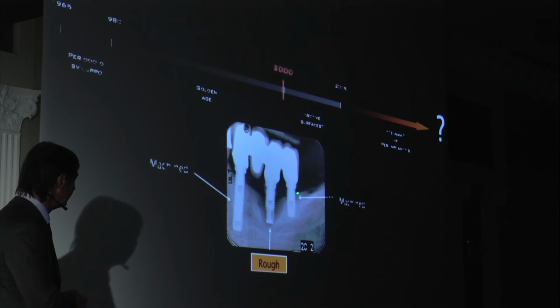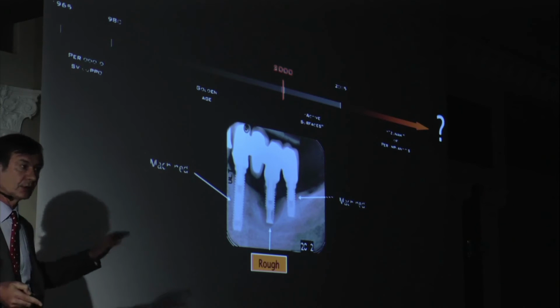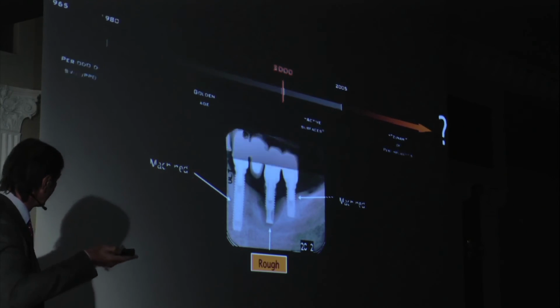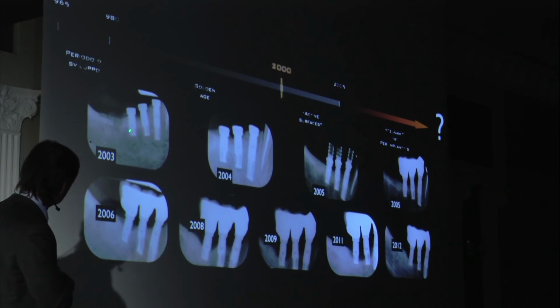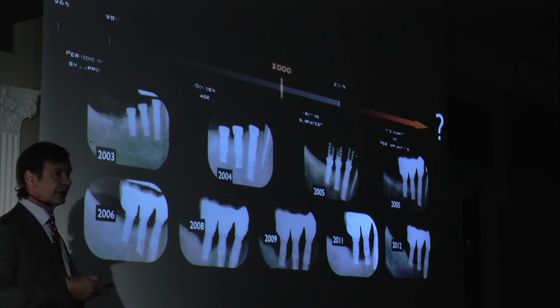This has been a little bit compromised by the defect of the adjacent implant. This implant is lost. And the patient was cleaning the teeth very well and was coming to the office every 3 months. Vertical augmentation. 2003, progressive bone loss without possibility of treatment in my office.